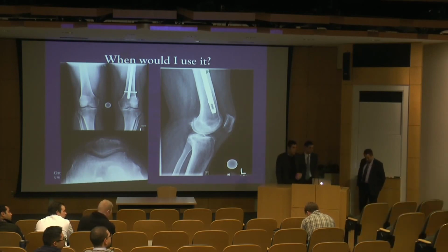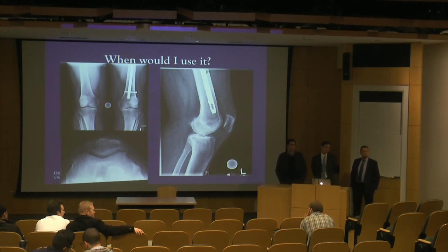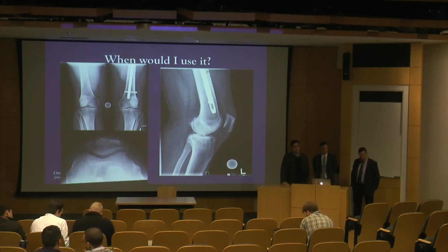My follow-up question was very similar, and it was going back to that case again. No criticism at all. No, honestly, that's just a brutally hard case. But I wonder if that was an example where a preoperative osteotomy, as a separate procedure, sometimes you can combine them, would have yielded something that was, in the end, better, and you wouldn't have been reliant on the navigation. And again, it's just one point about one case. But in general, I think we can't forget that there is a role for other procedures to help us get to the end result of an arthroplasty.